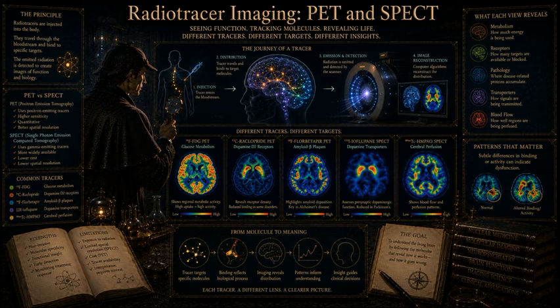In these models, the tracer acts as a substrate for a biochemical pathway. It enters the cell, interacts with an enzyme, but it has been chemically sabotaged so that it gets trapped midway through the metabolic process. The most famous, universally used example of this being 18-FDG, the workhorse of global PET imaging. Absolutely. 18F fluorodeoxyglucose. It is a chemical analog of regular glucose, the primary fuel source for the brain. 18FDG crosses the blood-brain barrier exactly like glucose. Once inside the brain cell, the enzyme hexokinase grabs it and phosphorylates it, turning it into 18FDG-6-phosphate. Which is exactly what hexokinase does to regular healthy glucose to begin the process of breaking it down for ATP energy. Precisely. But here's the trick of radiochemistry.